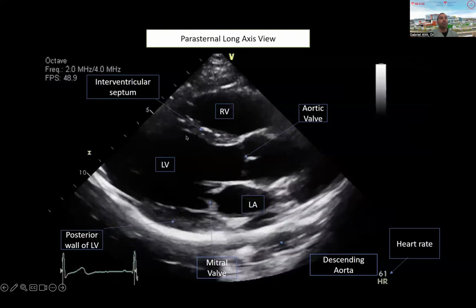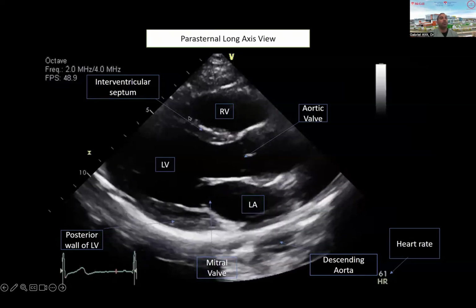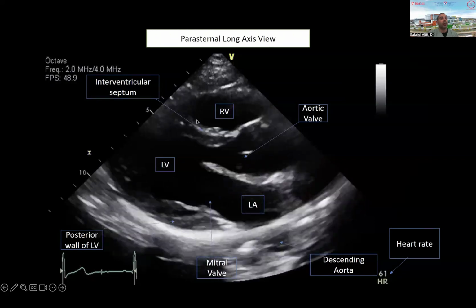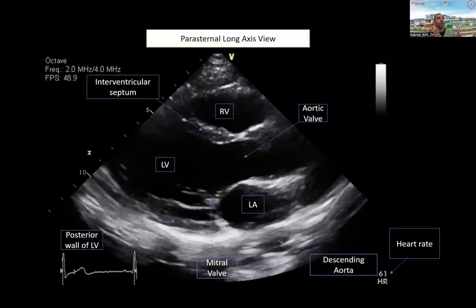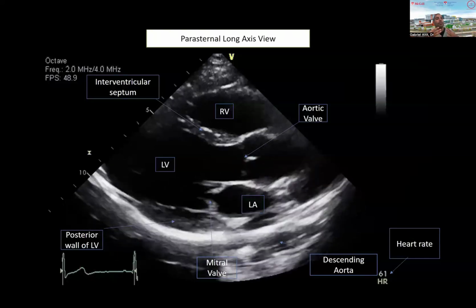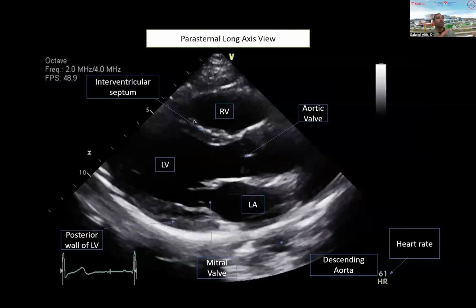And the septum of the left ventricle is typically very smooth compared to the septum on the RV side, where you can see there's a bit of crowding here. It's a bit more hypertrabeculated. So the RV is a hypertrabeculated mass versus the LV has very thin trabeculation and the septal surface is very smooth.